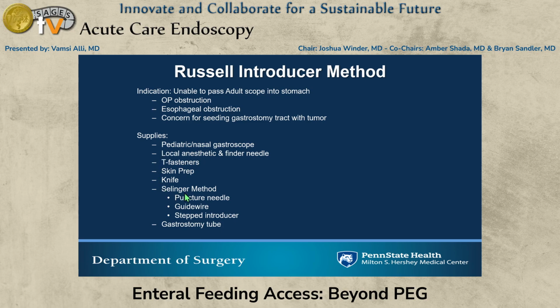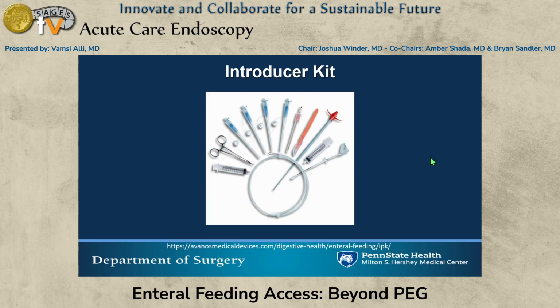Same elements of your kit in terms of fasteners, or the new addition. Everything else should really be in your traditional kit. It's the Seldinger method. I misspelled that. You're going to use a puncture needle, guide wire, or a stepped introducer, and then you can use your gastrostomy tube. Traditionally, you can use a balloon tube off the shelf, which is the easiest. There are some other deployable tubes that are available commercially as well.